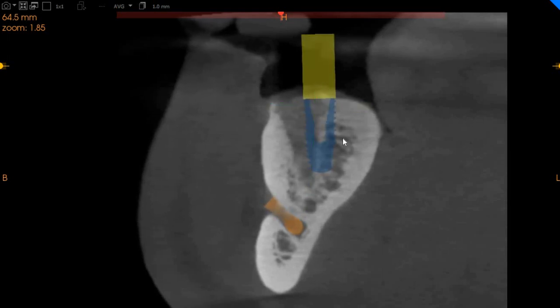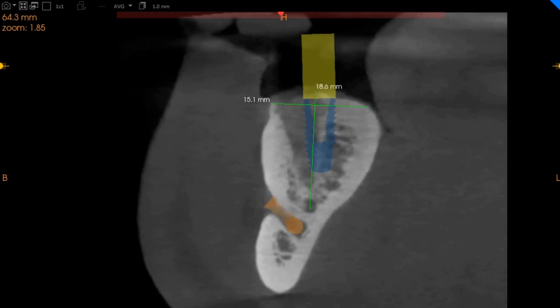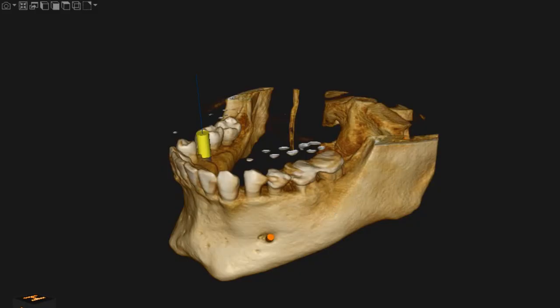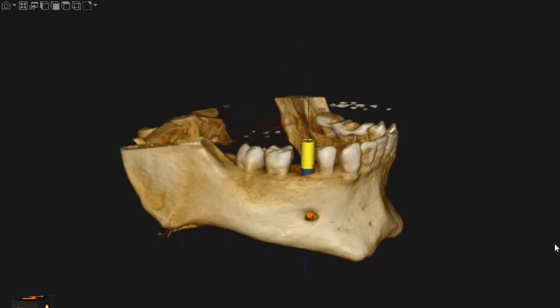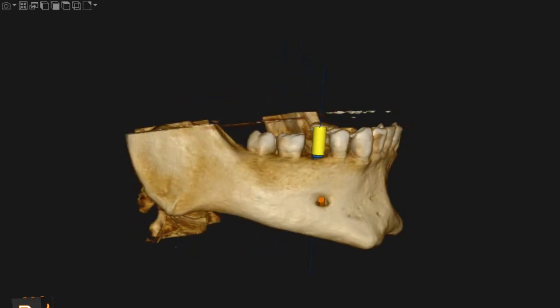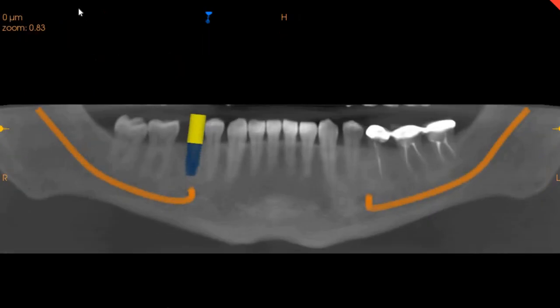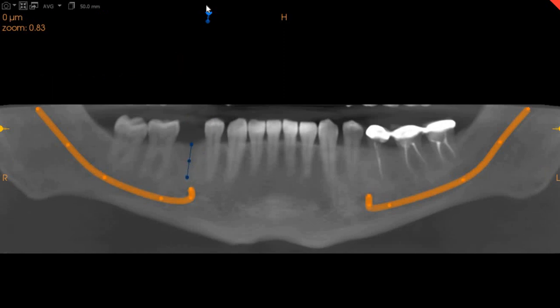This is a 5 millimeter diameter implant with 11.5 millimeters in height. This implant is in an ideal situation and ideal location, which can be used to restore this tooth. This implant should ideally be placed slightly more deeper for better bone adaptation.